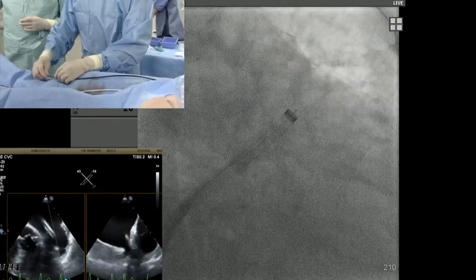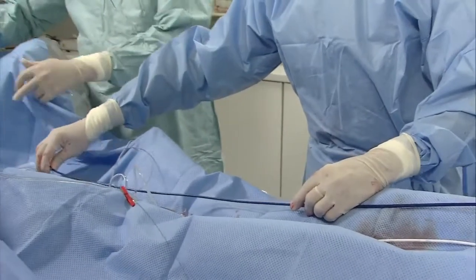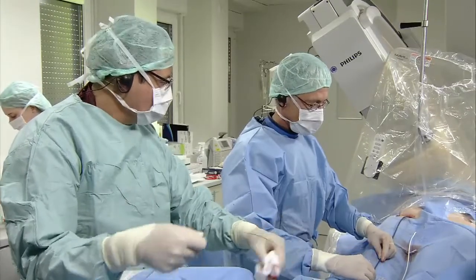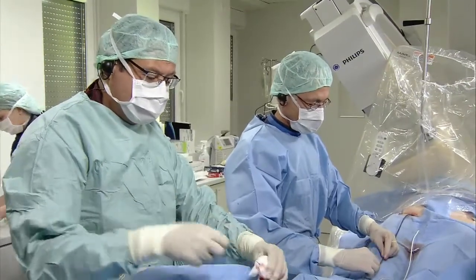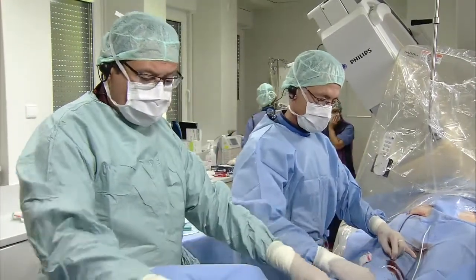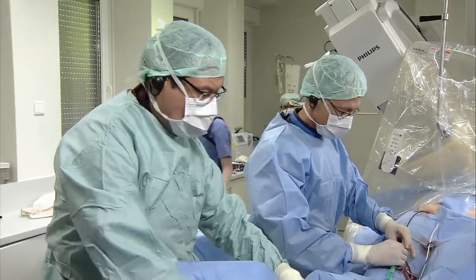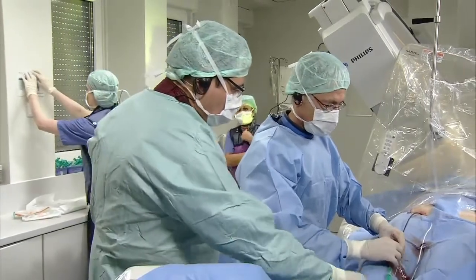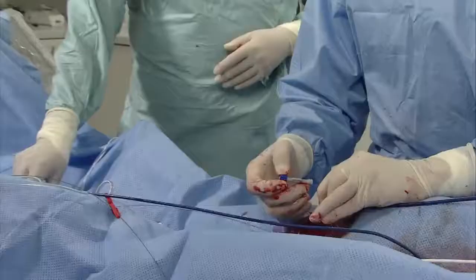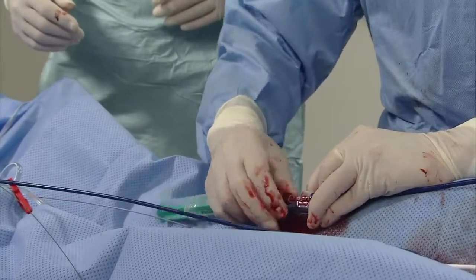Okay, please note that the marker is not at the distal end of the sheath. There's a distance of about, I think, 4 millimeters. And Horst, I noticed you took the wire out. Yes. I preferred to just keep that in until I get the blood back, but yeah, same. You obviously do it slightly differently. Maurice agrees with me. Yeah, sometimes inadvertently, whoever's moving one part or the other advances it, especially if you work with fellows and whatnot. So you have to be careful about that. I think it's an important part.